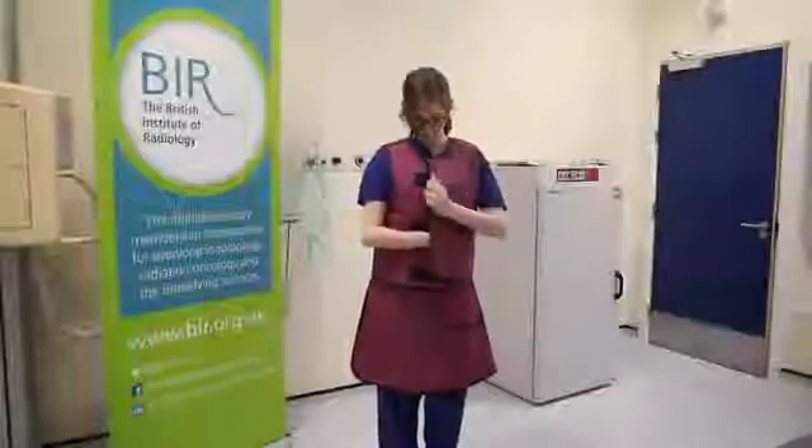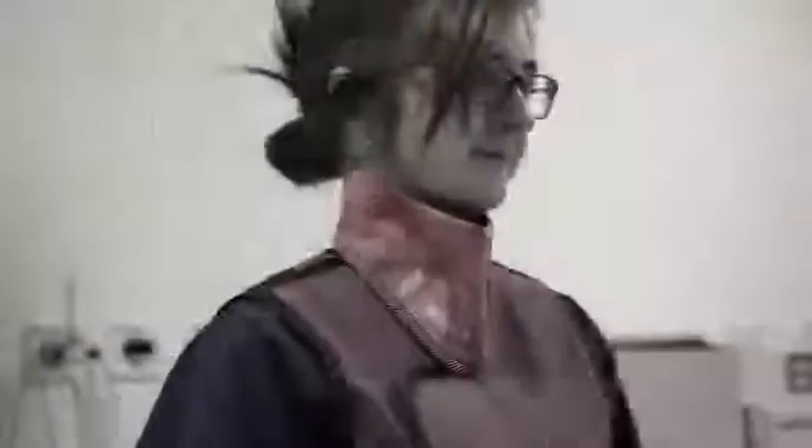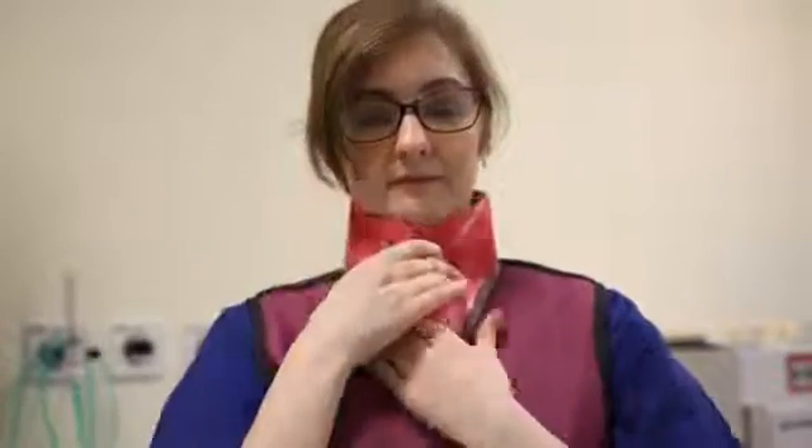Fasten the front to the top so the front edge is straight and there are no gaps. Your collar should follow the same principles as the rest of your PPE — not too big, not too small, but just right. Fasten it at the back. The front should overlap the top like this.